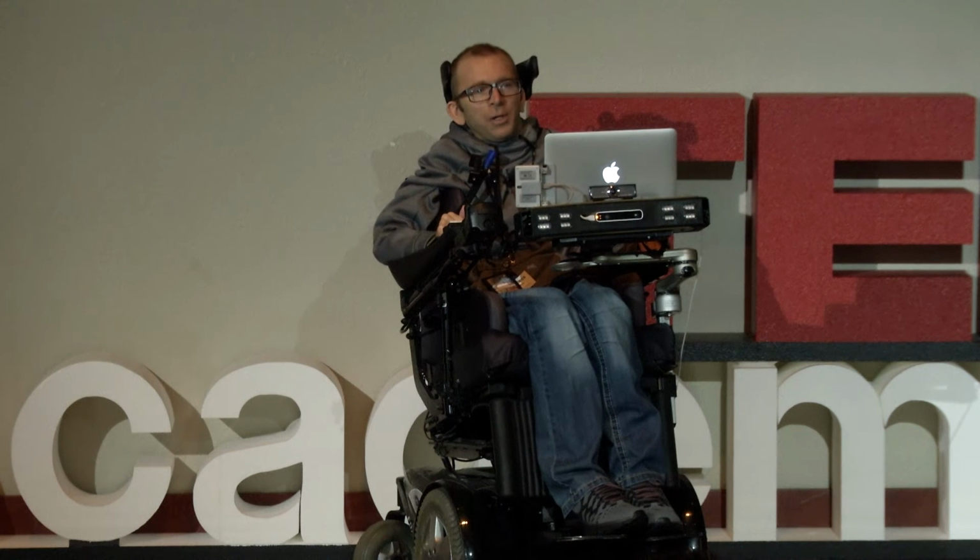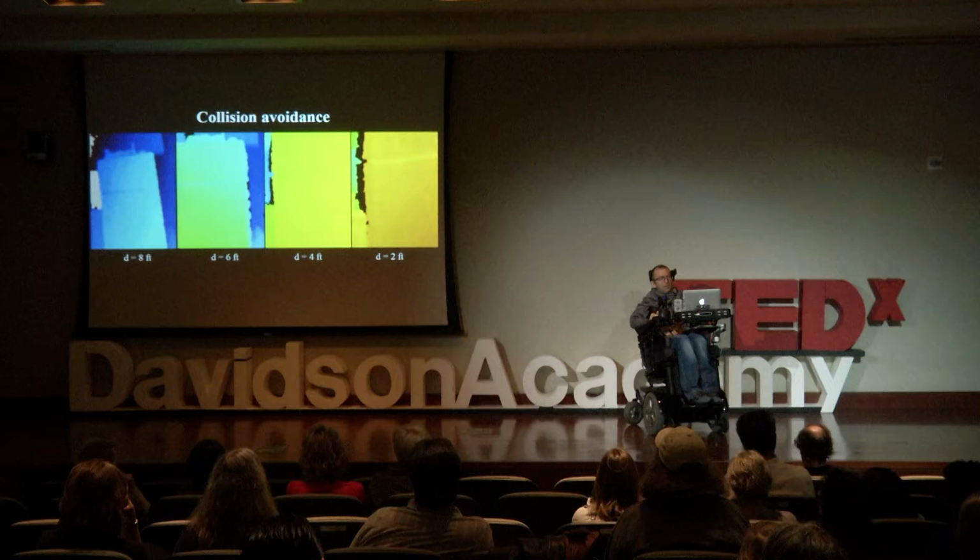So imagine we use that color and instead you have sound. So the closer you get to an object, the louder the sound gets and the more frequent it gets. So this should help anybody avoid collisions. Okay, next slide, please.